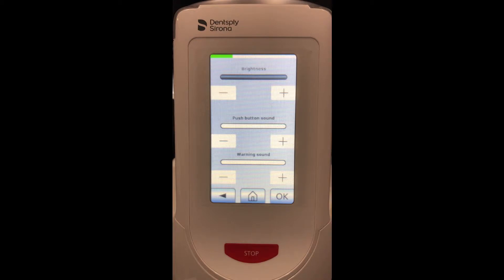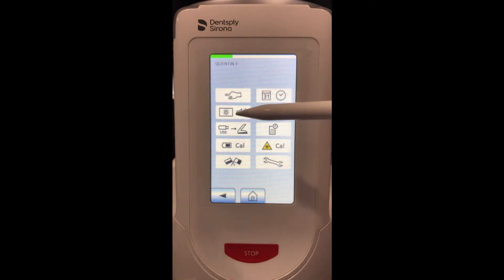Next we have this button which will take us to some of the device settings in terms of screen brightness and the sound it makes when you touch the screen. Currently I have it turned off, but if I turn it up, pressing buttons will beep every single time. I'm going to turn that off for the video. Warning sound is the sound the laser will make when the device is being fired; this can be set to low but it cannot be completely turned off.